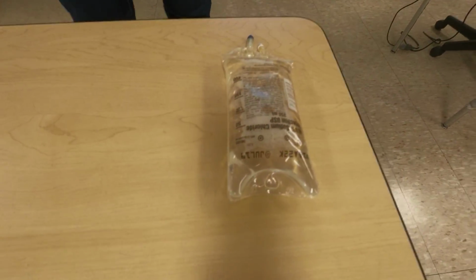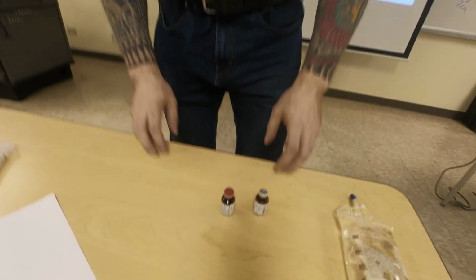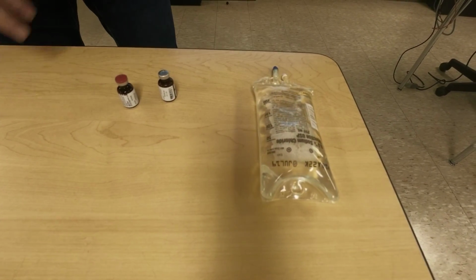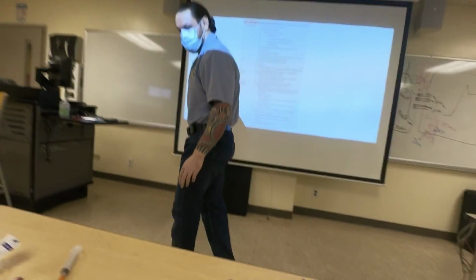So it comes in a vial like this. You're going to be mixing it in 100 ml D5W. This is saline; I'm just showing you as a demonstration, not what you're going to be doing. You're going to be using an administration set to connect it. My advice to you as you're preparing: put a label on it so you know what medicine you're giving. Use appropriate fluids, all that. Any questions about that?